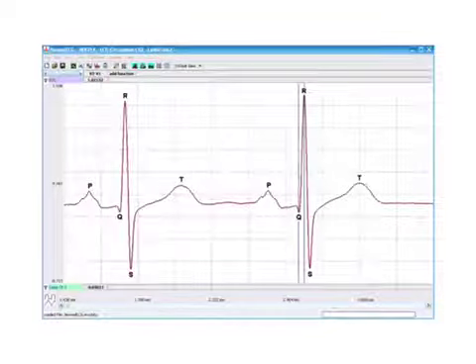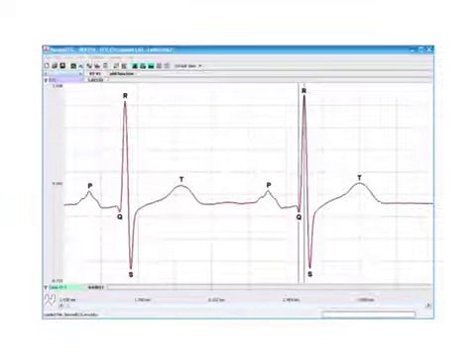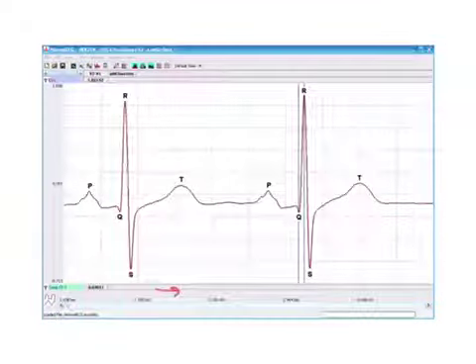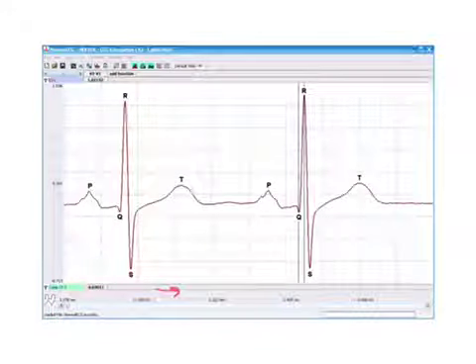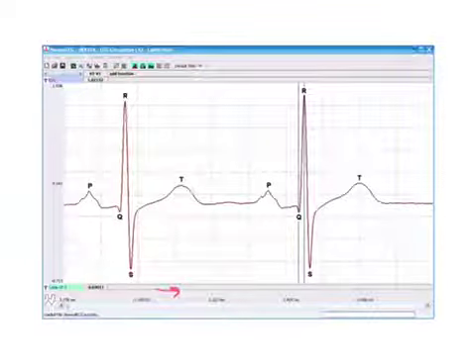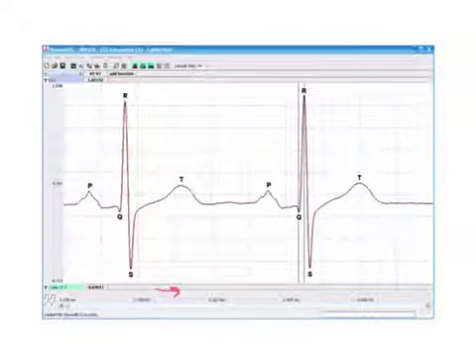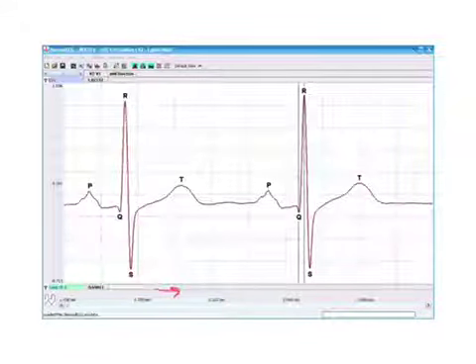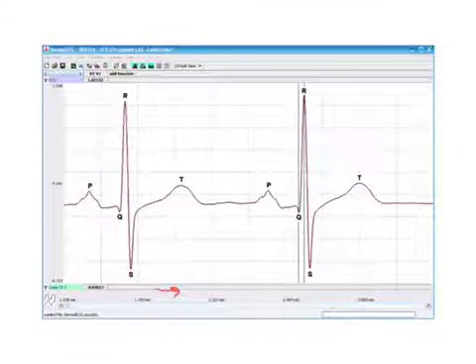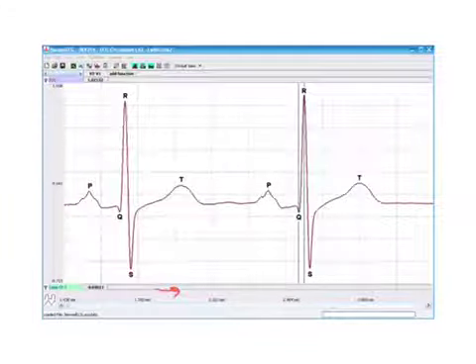If you would look just at the EKG file, when you do the analysis, this is what it should look like. You're going to have the other channel, the pulse, open too, but I don't have a picture of that. But you need to remember you're going to put a cursor here and a cursor here, and then you hit zoom between the cursors, and that will get you here. Don't forget to auto scale, and that will help you do the analysis.